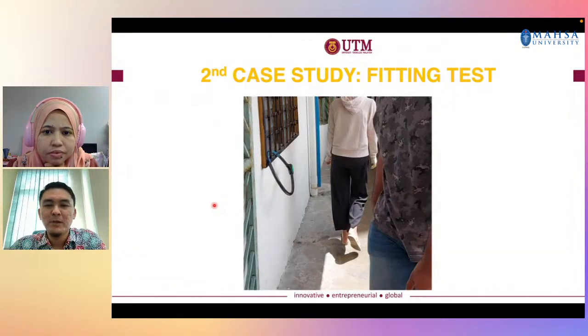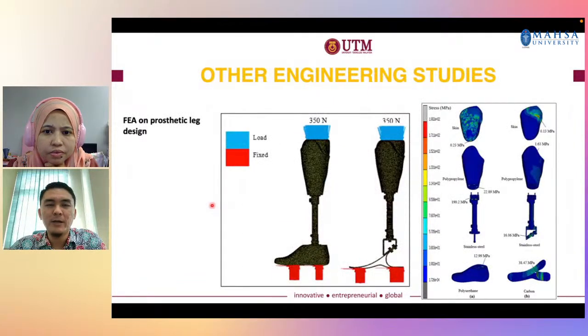Okay. And then I will maybe share something about other engineering studies related to prosthetics and orthotics. So this is the other study that we conducted in the laboratory. So we are trying to analyze different designs of the foot. So if you can see here, the foot region is different between these two.